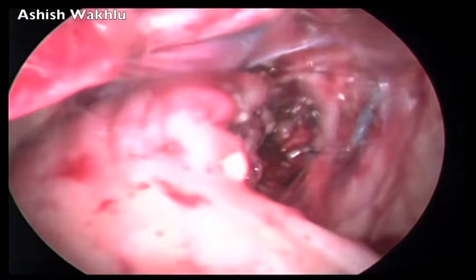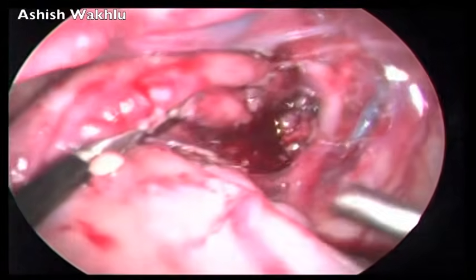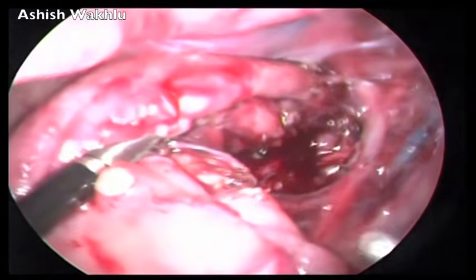The rectum is really very large in caliber, so it takes a bit of maneuvering to get the tissues into proper position for further dissection.